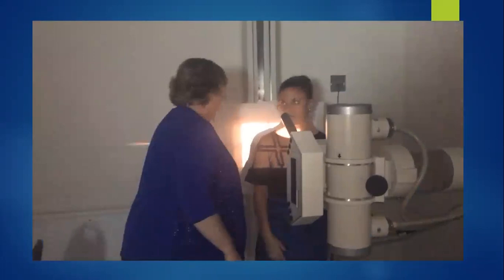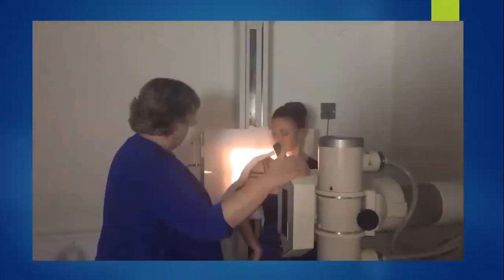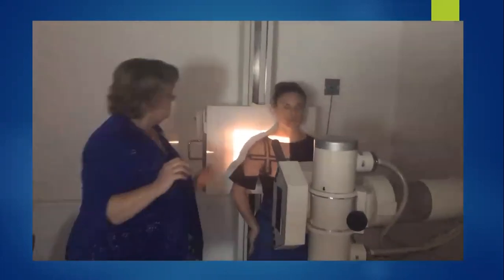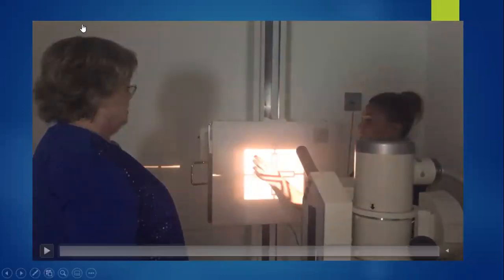Expose, hold your breath, don't breathe, don't move, expose. Switch out your IR. Internally rotate the hand until it's touching the back of the hip, and that is our internal rotated. Still 1 inch below coracoid. I'd bring her over just a slight bit maybe, but that's pretty good. Everything's centered. You have all around the shoulder on there. Room for your marker above. And that's our two easy AP views: internal, external, AP lateral.